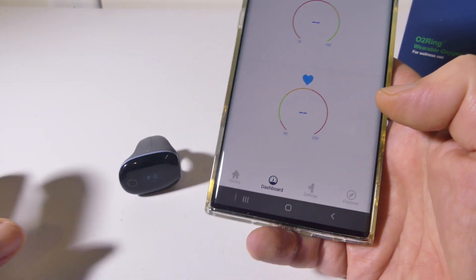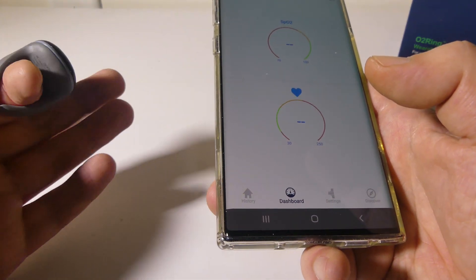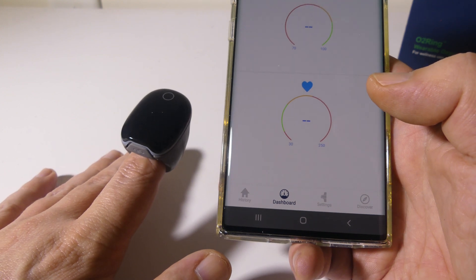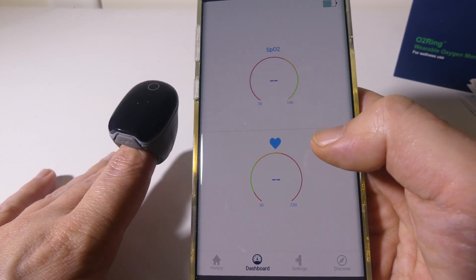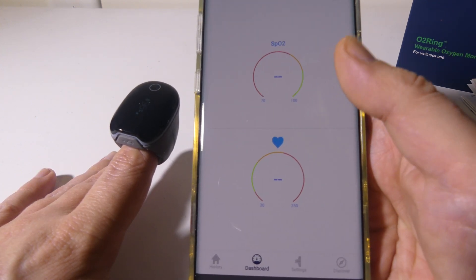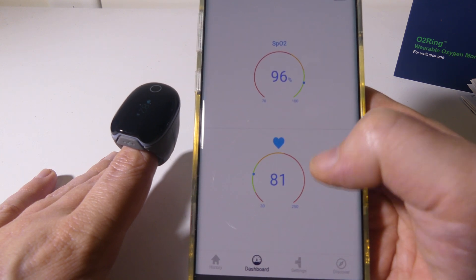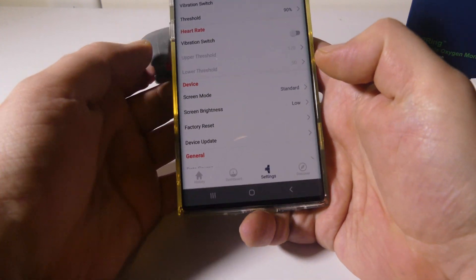The live dashboard in the app is pretty cool too. Sliding it on my finger — even if it's backwards, it'll read front or backwards; the display will just be upside down. It takes about five to ten seconds to start getting a reading, and then the live dashboard shows my SPO2 and my actual heart rate in real time.